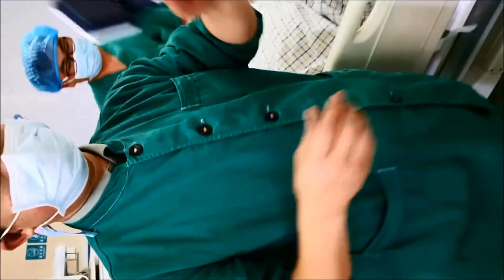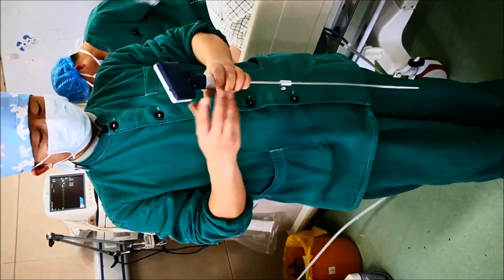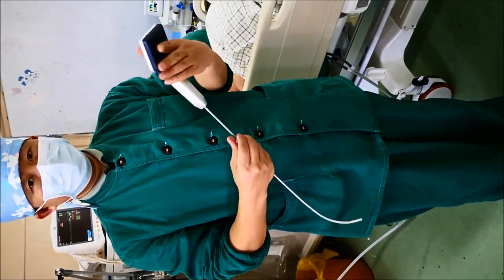This device is invented by our Chinese Professor Zheng Ji-Hua, who is the most popular and well-known for making this the easiest scope to use.